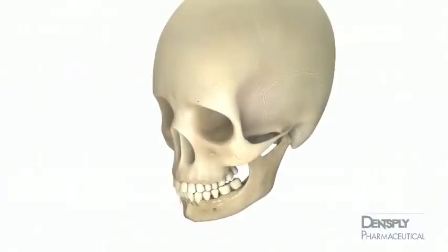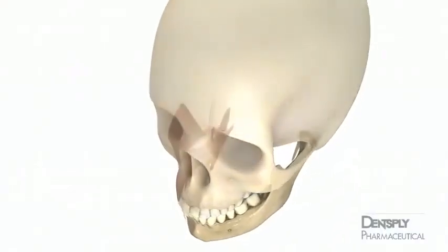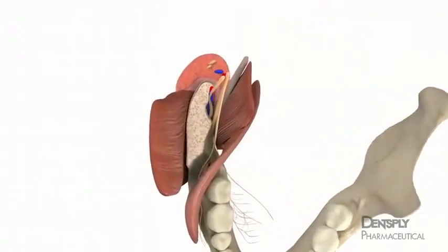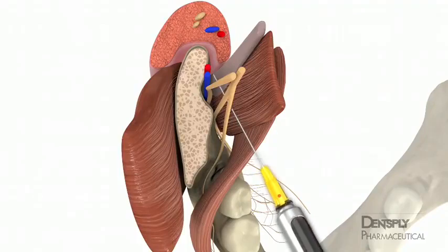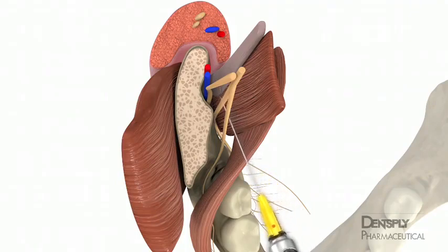In the patient where no bone is originally contacted after an insertion of 2.5 centimeters, there is the possibility that the needle tip is medial to the mandibular sulcus. Deeper insertion is not advised because of the potential for penetrating the parotid capsule and anesthetizing the facial nerve. Depositing the anesthetic at this point will still usually produce mandibular anesthesia.